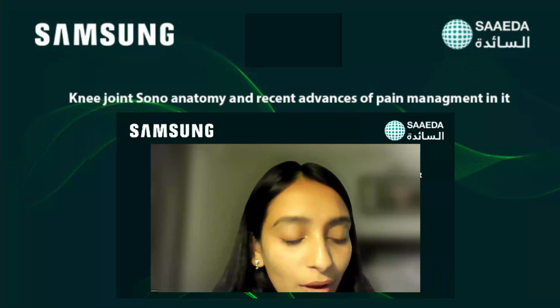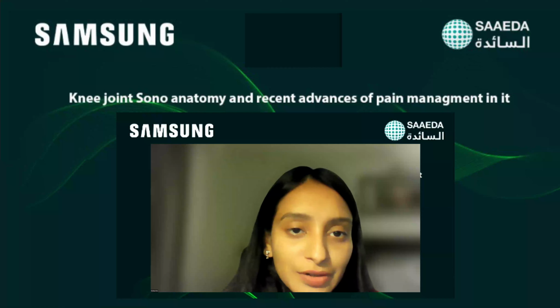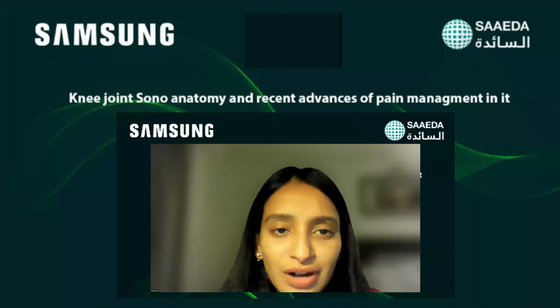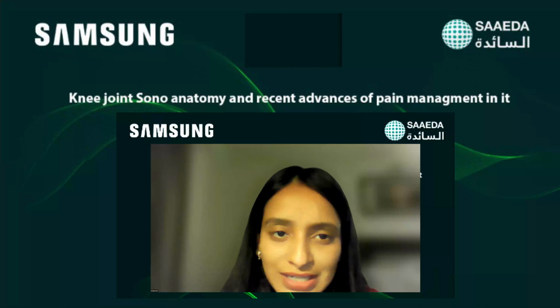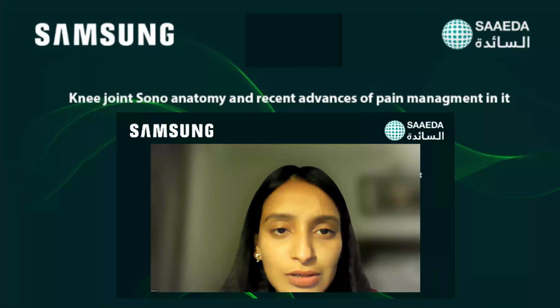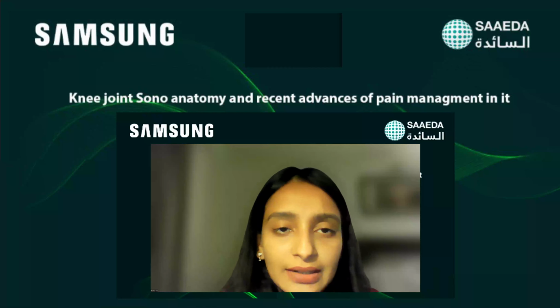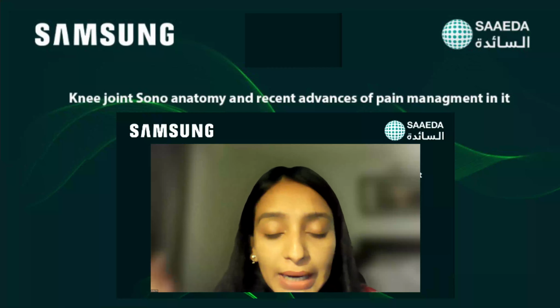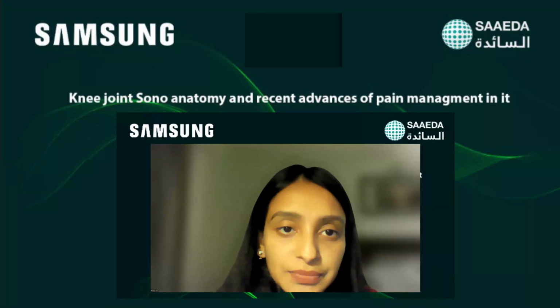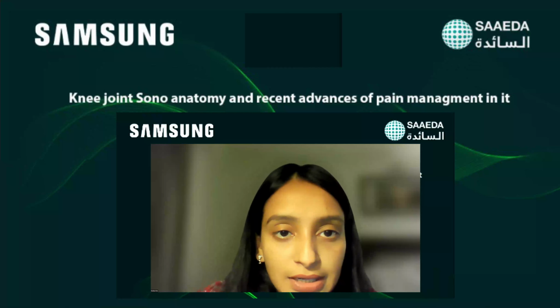Sir, if I'm very honest with you, I started my pain journey locating the separate nerves. My experience in intra-articular injection is very less. I haven't seen it at all. Mostly, as Dr. Sabha will also agree with us, we have been locating these three nerves, and at the max, what we can do is combine fluoroscopy along with the ultrasound. So hardly any these days we are doing it intra-articular.